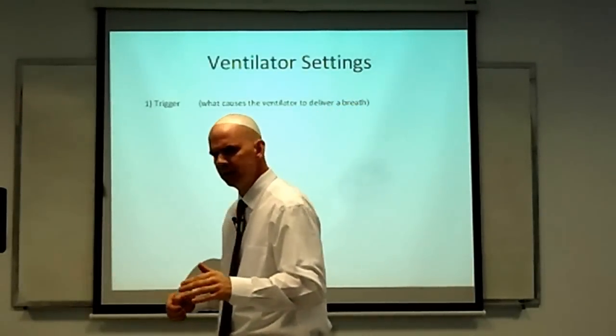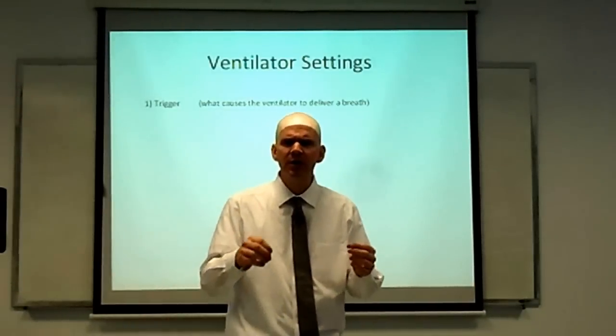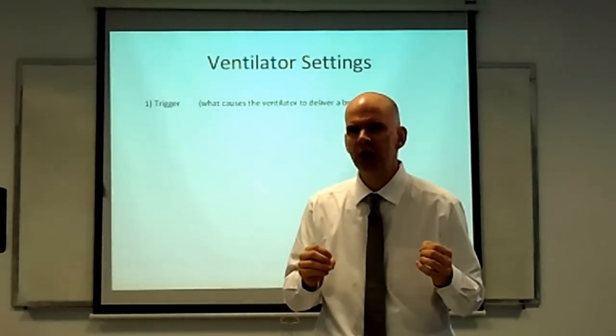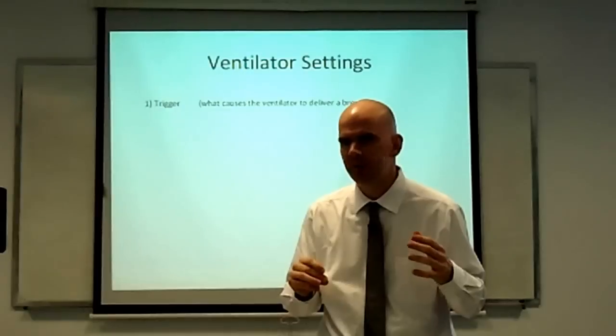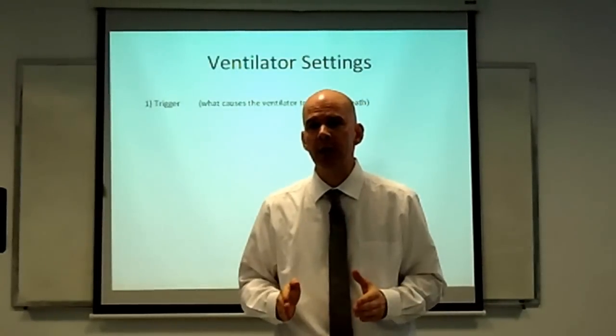Okay, so let's set the sensitivity really high. Then we have another problem, because if the sensitivity on the trigger is set really high, then the machine is on a hair trigger, and it's going to fire at the drop of a hat. And it might fire at inappropriate times.